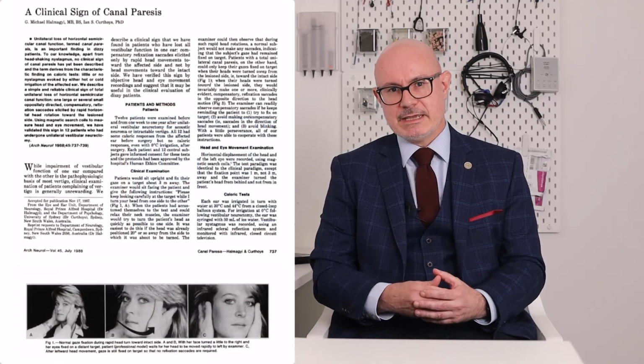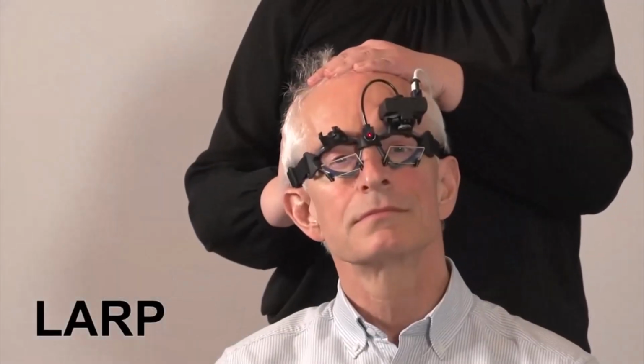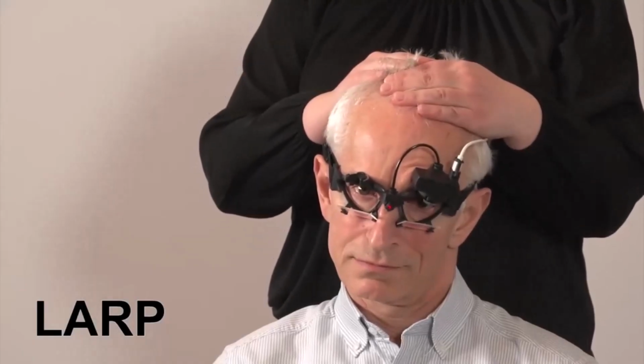Now, head impulse testing really comes back from the bedside. So Halmagyi and Curthoys described this in the late 1980s, looking at eye movement behavior relative to impulsive head movements. We saw that that was then developed through the technological advancement of lightweight goggles and cameras into what has now been used for over 10 years in clinic, the video head impulse test. And what we're doing with that video head impulse test is really measuring the physiological function of the VOR at these higher frequencies, so complementary to our low frequency caloric and rotational chair testing.